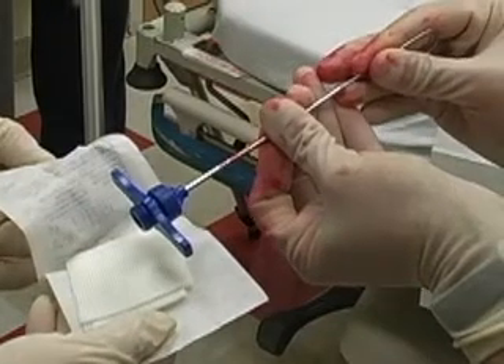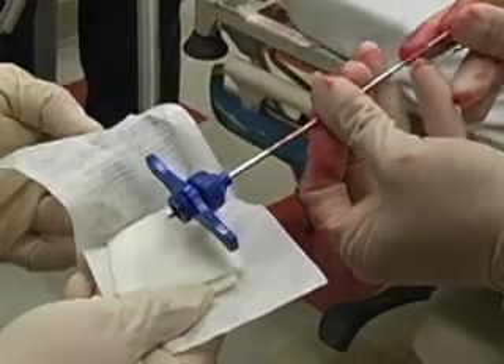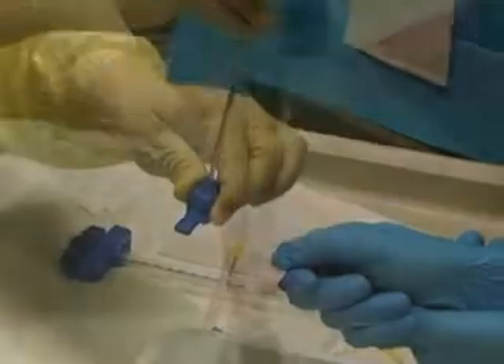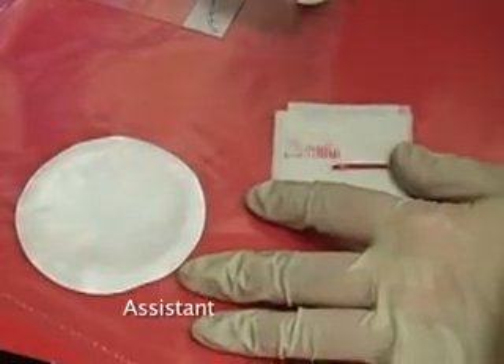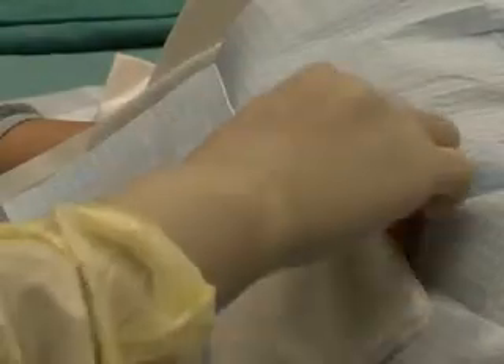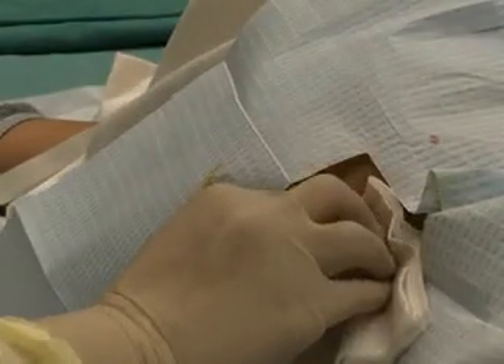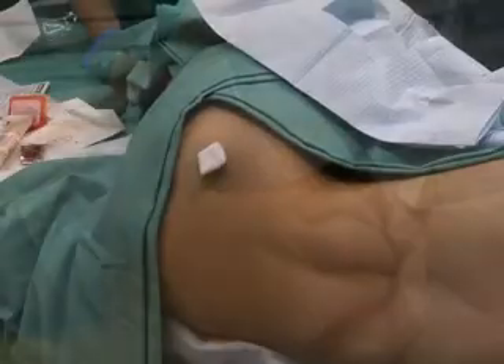Remove the specimen from the needle by inserting a sterile probe into the distal end of the needle and push the specimen through the hub onto sterile gauze or a slide. Inspect the specimen for adequacy of marrow. Apply pressure to the biopsy site with gauze until any bleeding stops and cover with a bandage or pressure dressing.